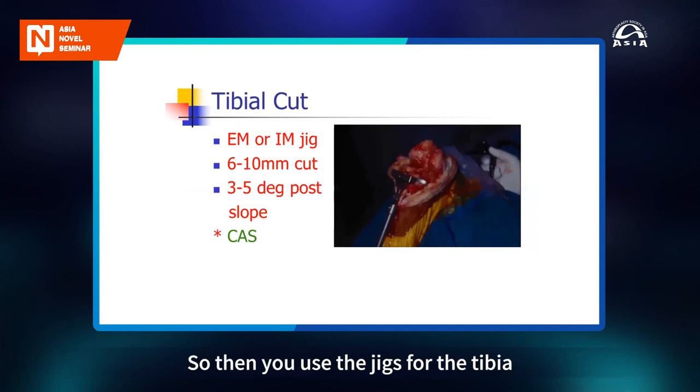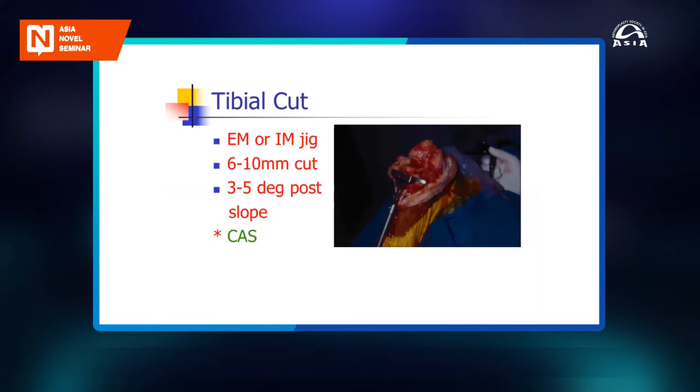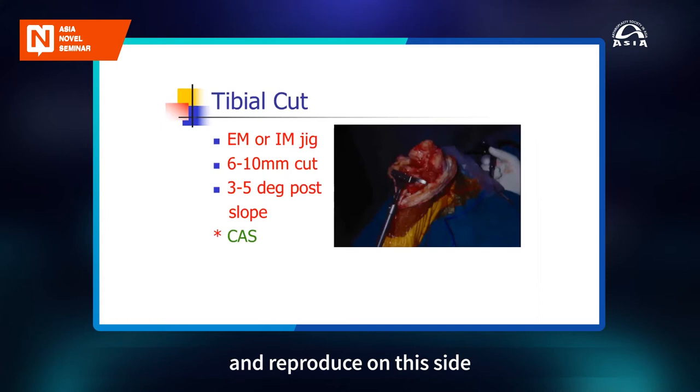So then you use the jigs for the tibia. Extramedullary jig is usually better. You make a 6 to 10 millimeter cut and a posterior slope, usually 3 to 5 degrees is enough. If you have the other side absolutely healthy, you can make measurements on that side and reproduce on this side.